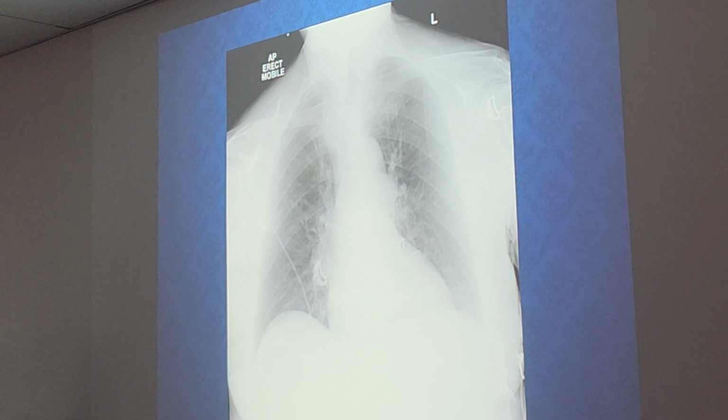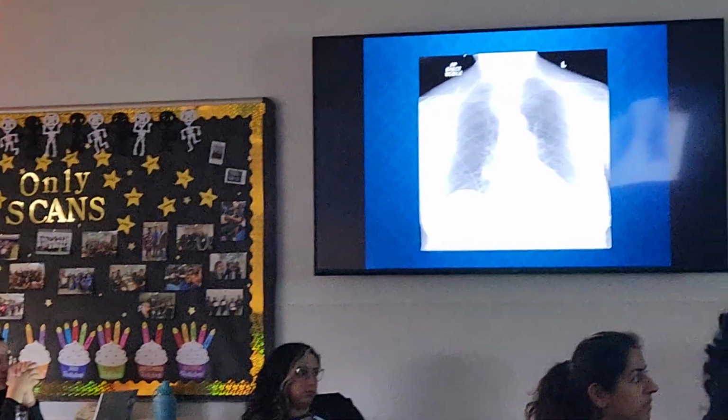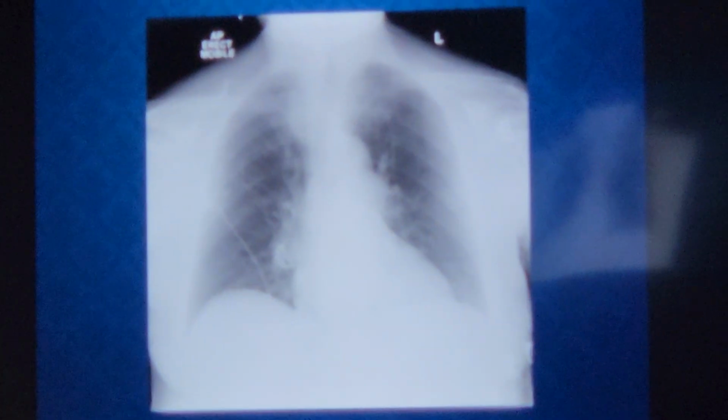Are the S values different for portables compared to the range you gave us? For some, yes. So for the evaluation criteria, can we go off of that? Because on one of the chest X-rays, I had the S value at like 10,000. That's probably a machine error. There's no way your S value should be at 10,000.